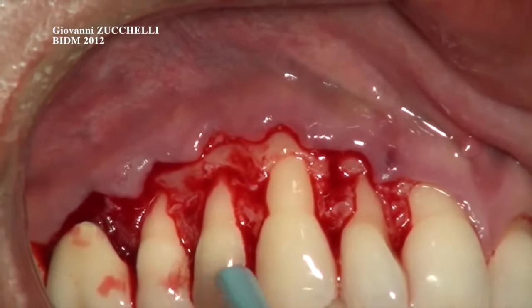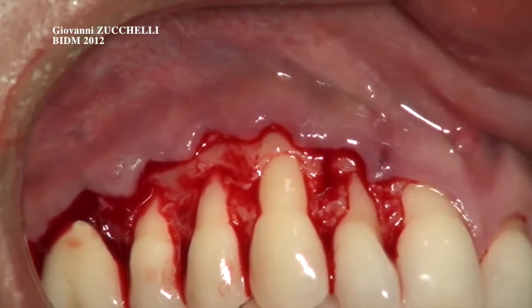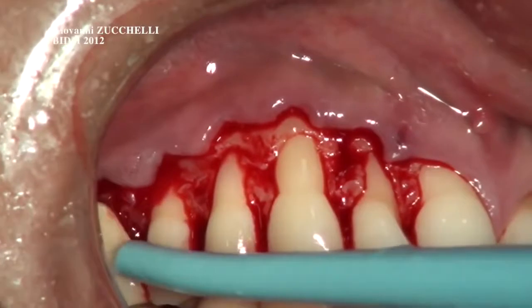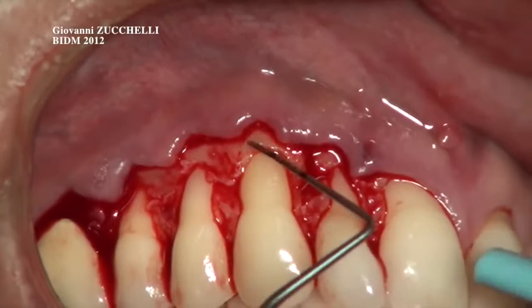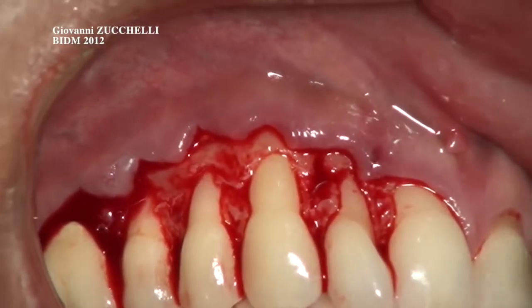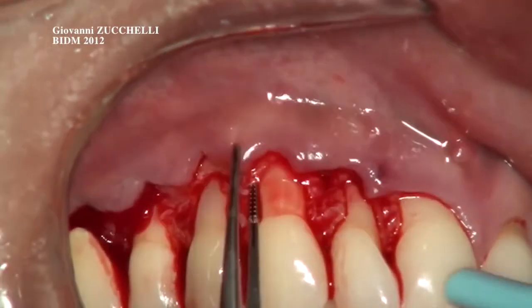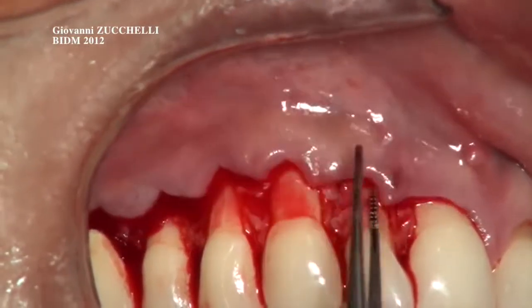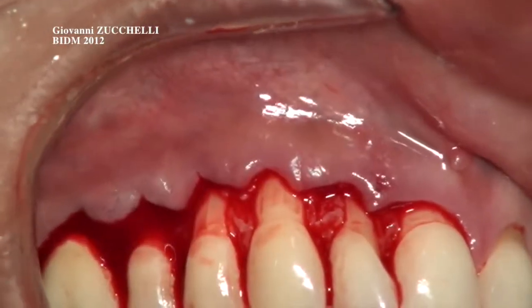By suturing our flap to our surgical papillae, which were elevated split thickness, to the corresponding anatomic papillae, which were desepithelialized. You see that every surgical papilla has a triangular shape like the anatomic papilla, and once this surgical papilla is placed above the anatomic papilla, the coronally advanced flap will cover the crown of the tooth.